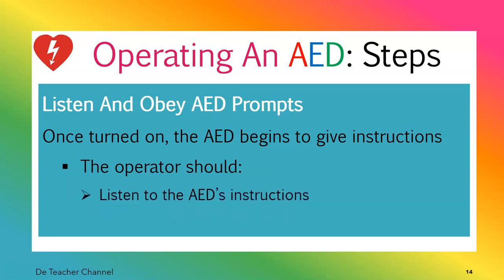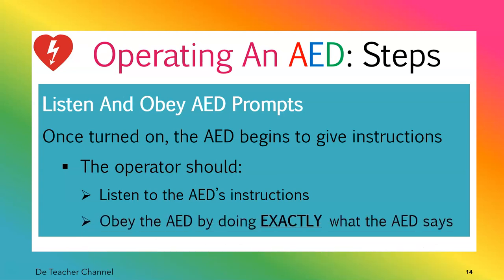Listen to the AED's instructions. Obey the AED by doing exactly what the AED says. No argument. AED doesn't need your opinion. Do exactly what the instructions from the AED say, and you'll be fine.